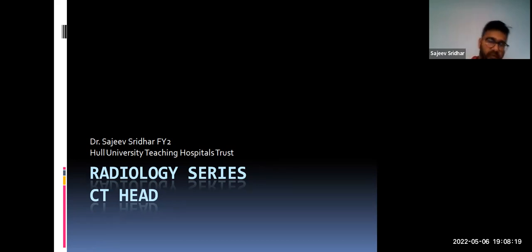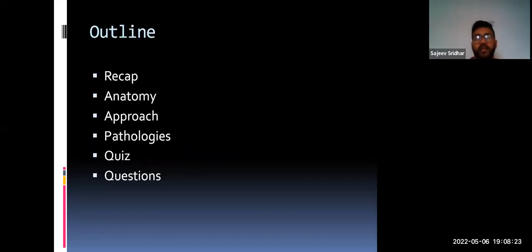Right. So without further ado, what we'll be discussing today. I just want to do a quick recap on what I've already spoken about in chest X-rays, particularly about what X-rays can actually do and how it is different when we are CTing someone as opposed to just an X-ray. We'll be looking at the basic anatomy of what you have to look out for in a CT head.